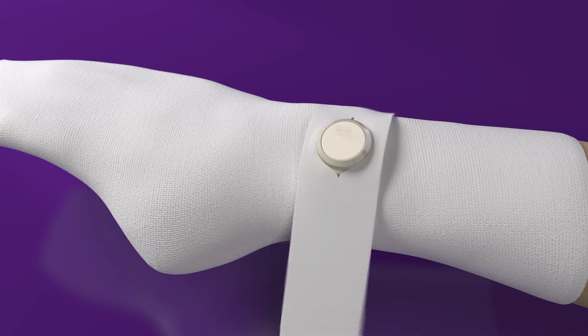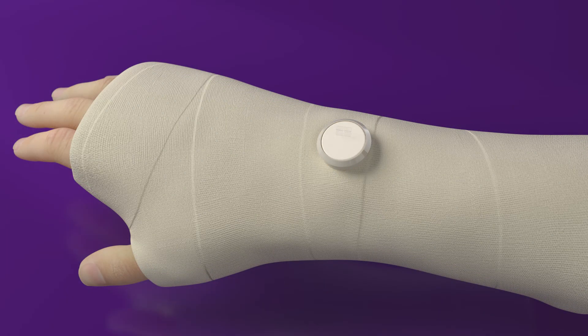Apply the CAST felt split, or cut a hole to fit over the RAF. Apply the rest of the CAST padding. Putting the RAF through the hole will help hold it in place when finishing the CAST. Apply one layer of synthetic CAST material.